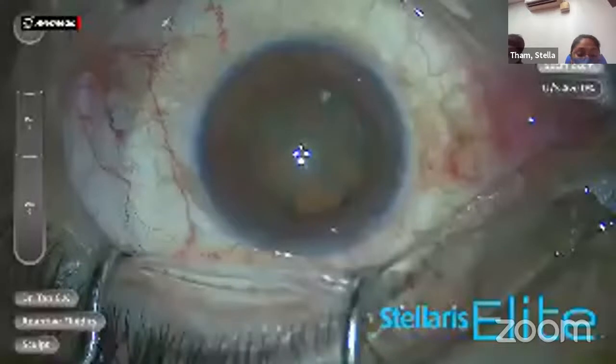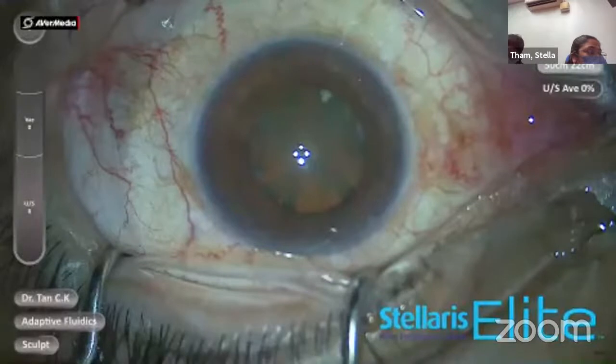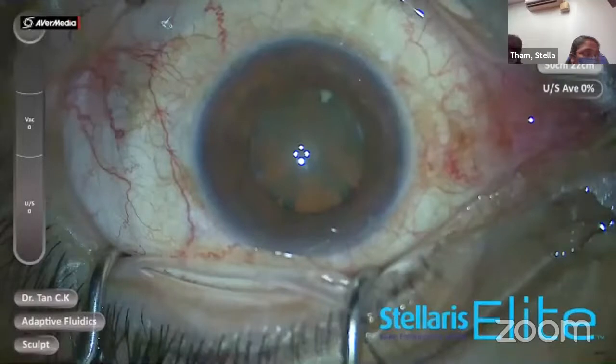I'll be presenting the phaco case that we did on Tuesday, the 17th of August. Patient's name is Ahmad Faisal bin Mat Saleh. Sorry. He has underlying diabetes, hypertension, dyslipidemia, chronic kidney disease, and coronary artery disease. A case of left eye cataract, right eye pseudophakic, and right eye severe NPDR with left eye ADED, with vision of counting fingers 3 feet.